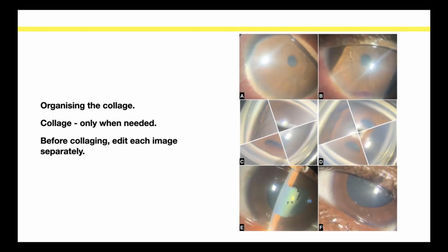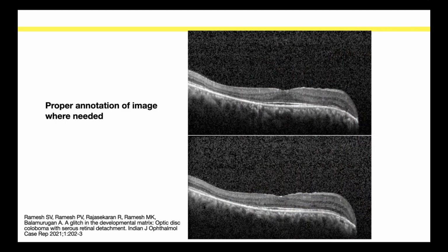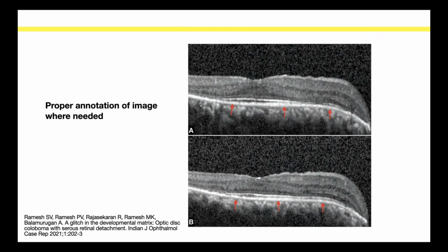And you can see again aligning your images. Also, today tools are there where you can prompt and get it aligned in a very sequential manner. So this is your PA that is done. This is the gonioscopy. This is PI-PA, or rather YAG-PI, gonioscopy done, then dilating the patient. So getting your image aligned on a single level can also be given as a prompt to the tools, which I'm going to show you further. The image has to be represented nicely. Again, annotating an image. So this is the image, my dear friends. Annotating the image can also be done by prompts.